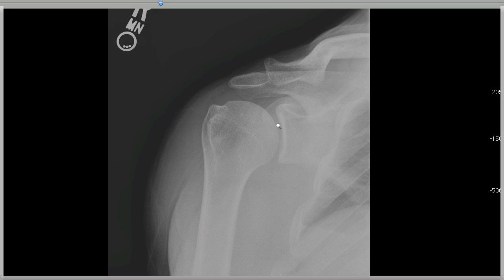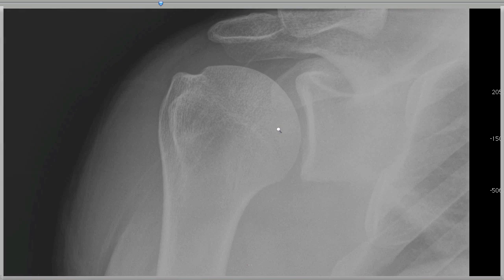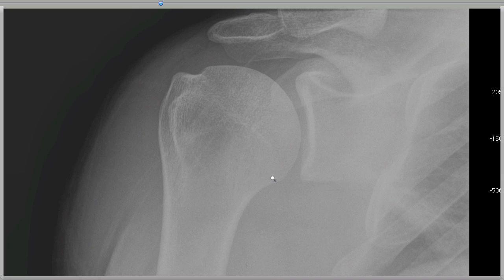The Grashey view has the patient obliqued such that one can see down the glenohumeral joint. This gives a better appreciation of the actual joint thickness or cartilage space within the joint, the smoothness of the humeral head and the glenoid in a normal patient. This shows the external rotation view of the humerus where the articular surface is here, the greater tuberosity projects out, and the lesser tuberosity is here, delimiting the bicipital groove between those two.